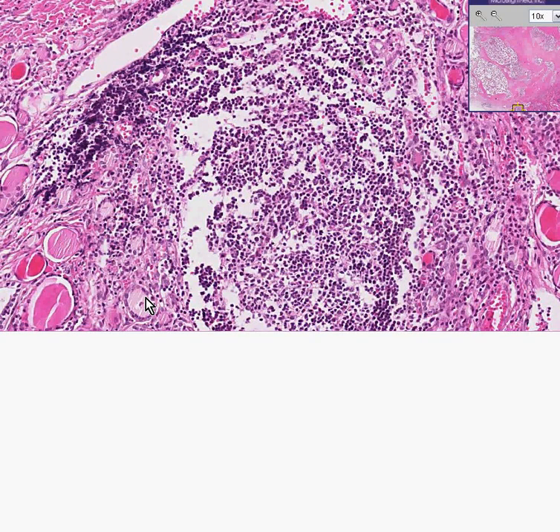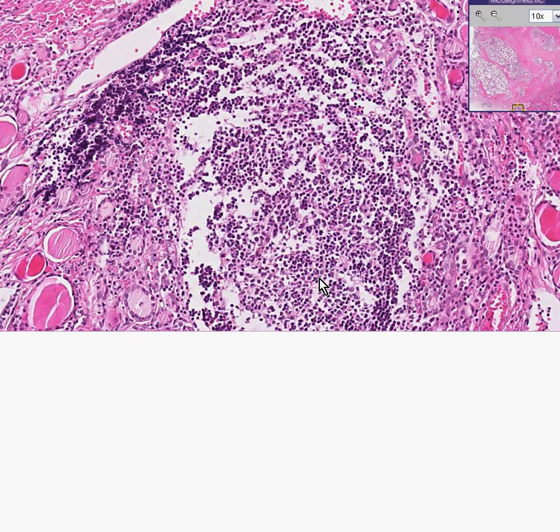If this was a thyroid gland — and it is, because you can see little follicles here and here — it seems to be disrupted by these fairly well-defined lymphoid follicles. If this was a thyroid, you would call this Hashimoto's thyroiditis, and then just look at your next slide.